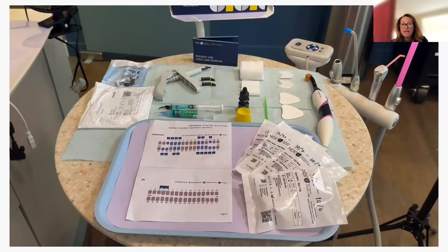But the sheet that I was telling you that most aligner companies will send is right there. I like to have it out, so I know exactly where my attachments are. Before you begin your etching process, like I said, I like to try the trays in. I will dry my template off, but when I have it in the patient's mouth, I am aware of where all those attachments are going to be.